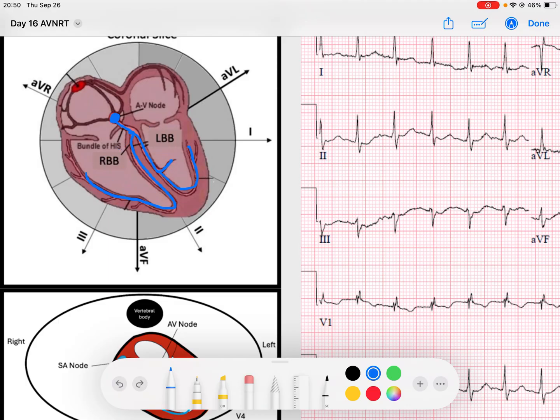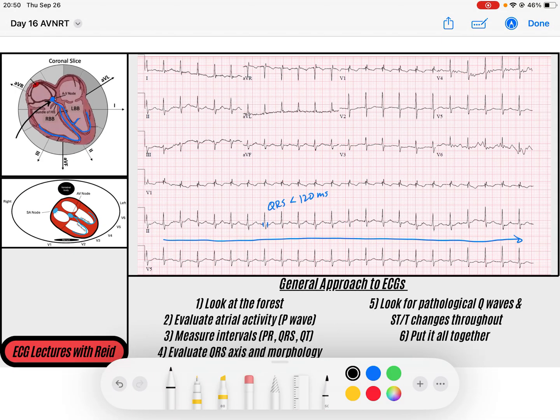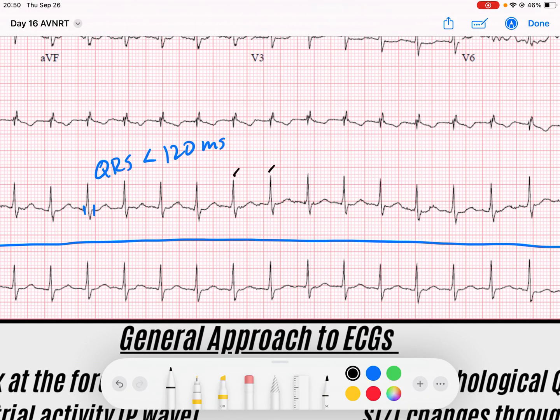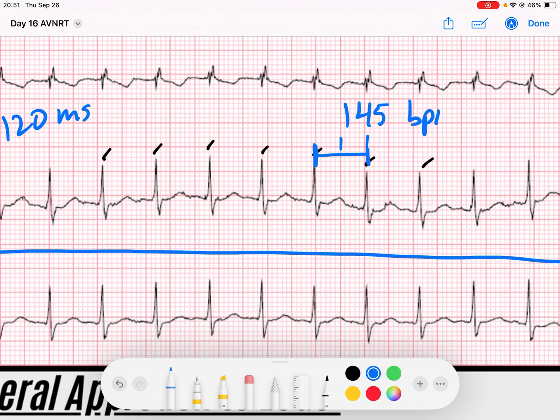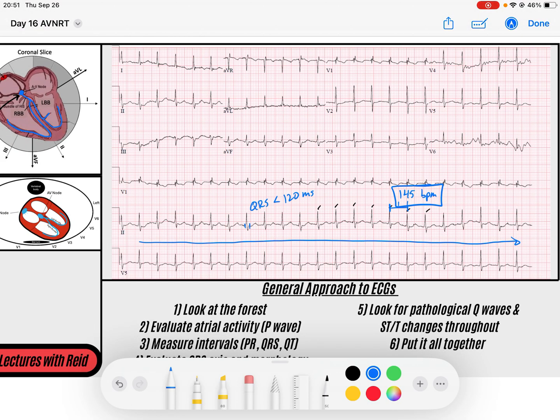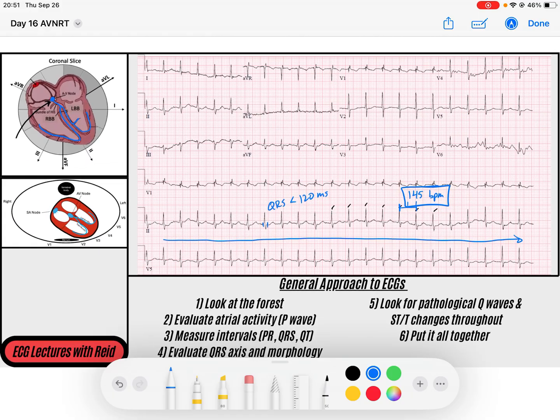This rhythm must be arising from the AV node or higher — a supraventricular origin. It's very regular; these QRS complexes are occurring at quite a predictable pattern. To determine the rate, I'll pick a QRS that lands on a solid line — that gives us about 145 beats per minute.